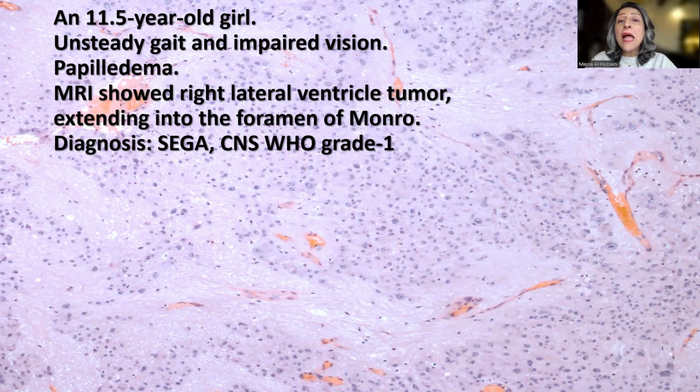family members. And remember, sometimes you might be challenged if you make such a diagnosis without a history of tuberous sclerosis. But remember the triple immunohistochemical profile, GFAP positivity, S100 positivity, and TTF1 positivity, in the right clinical, radiological, and morphological context can help to support your diagnosis.